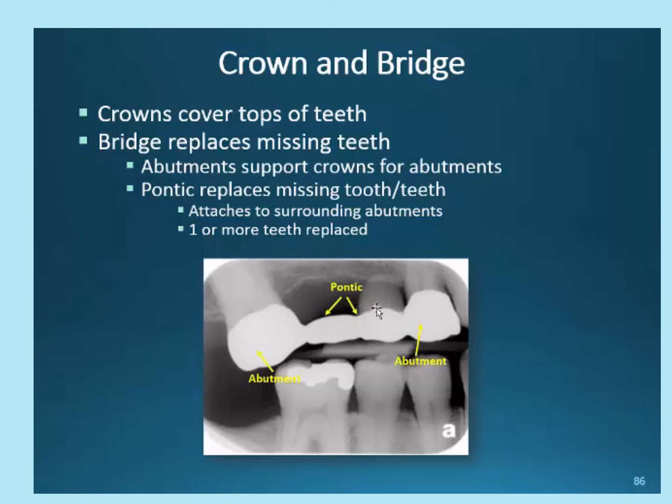Note that there is another type of material creating the illusion of a false tooth there. This is porcelain or some other type of acrylic. I'm also noting that there is another tooth here. It may be made out of different material and it's not radiographing at all. But this whole bridge work looks like a bridge that is made out of gold, in my opinion. We would know that if we did a visual exam to confirm.